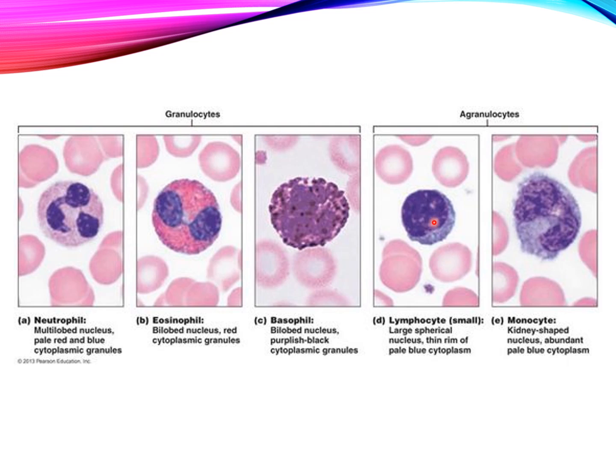Lymphocytes over here, the whole nucleus again is staining purple, taking up the whole cell, and they do have slightly blue or basophilic cytoplasm around that large nucleus. And then the monocyte on the end, you can see takes up the basophilic dye. It usually has that kidney-shaped nucleus. They are bigger than the rest of the white blood cells, and it usually has a blue, almost foamy-like appearance in its cytoplasm, where there are vacuoles kind of making holes in the cytoplasm, which makes it have this foamy appearance.